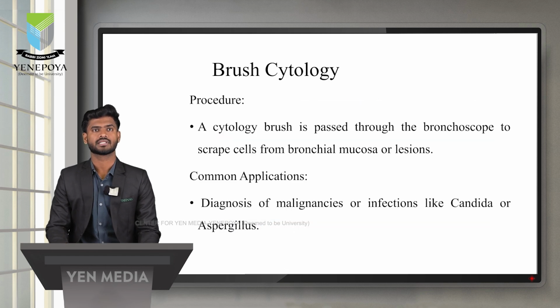Next, the third one is brush cytology. A cytology brush is passed through the bronchoscope to scrape cells from the bronchial mucosa or lesions. Common applications are the diagnosis of malignancy or infections like candida or aspergillus.